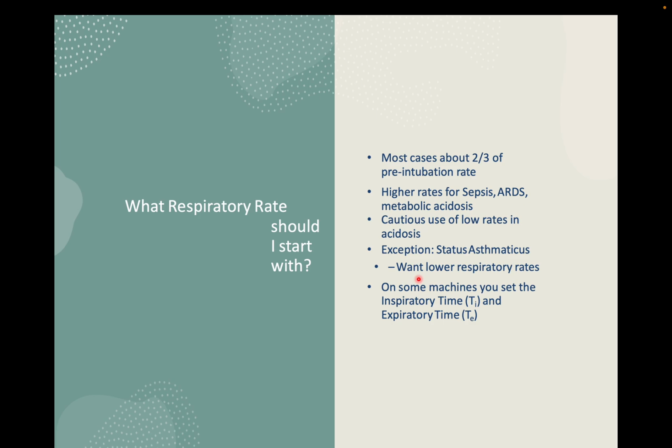So what will it cause? It will cause auto PEEP, and it will cause more hypoventilation, because there is already end expiratory pressure due to insufficient clearance of the tidal volume we are inspiring. So it will cause auto PEEP generation and hypoventilation. That is why in status asthmaticus we generally prefer a lower respiratory rate, so that it gives enough time for the lungs to expire in the already existing obstructive lung disease. So that depends upon the inspiratory time and expiratory time.